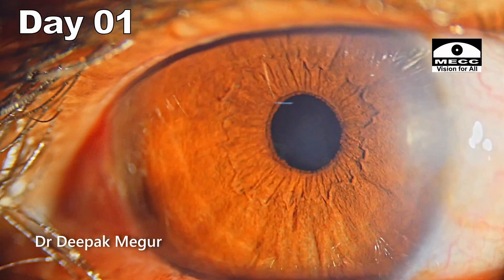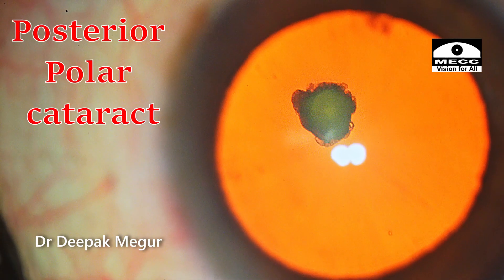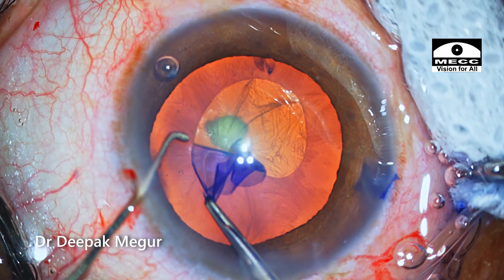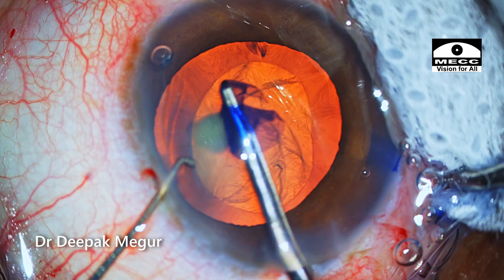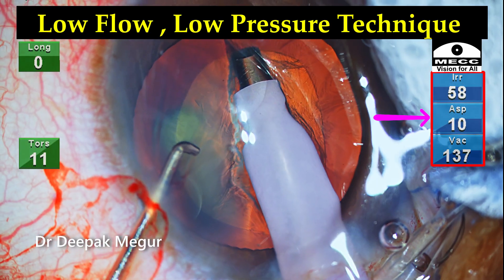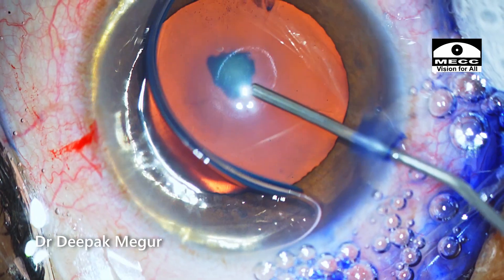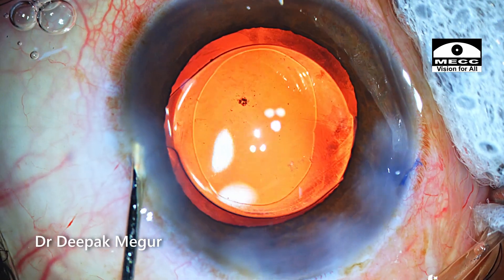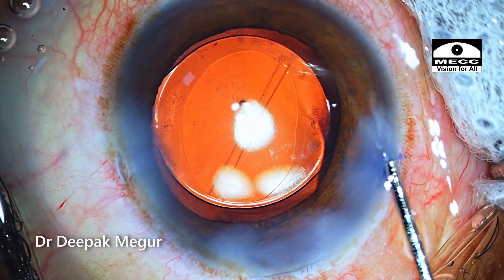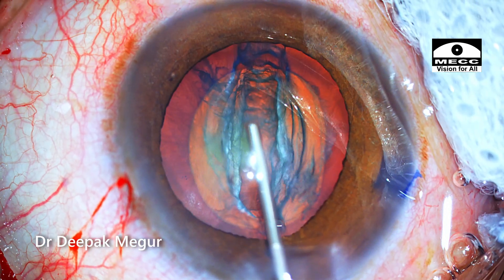This is the first-day post-op picture and she was fine. This was a posterior polar cataract suspect patient. The surgery was planned and strategies were changed to prevent any posterior capsule tear. I followed the principle of low flow, low pressure surgery throughout the procedure — from injecting OVD into the eye to stromal hydration for wound closure. Care was taken that the eye was always kept soft, and overinflation or pressurization of the chamber was consciously avoided.